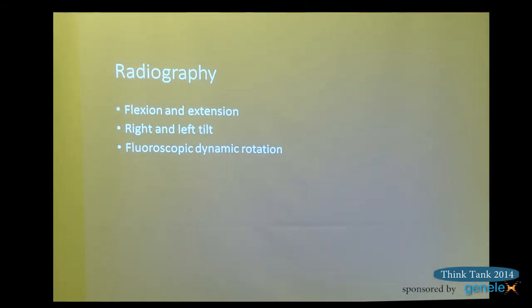We also do radiography in that the open MRs take 4 or 5 minutes per sequence. Some patients can't hold still that long. They're able to push or bend further in the radiography suite for a few seconds than they would be holding for 5 minutes.